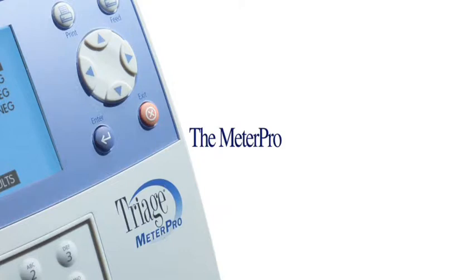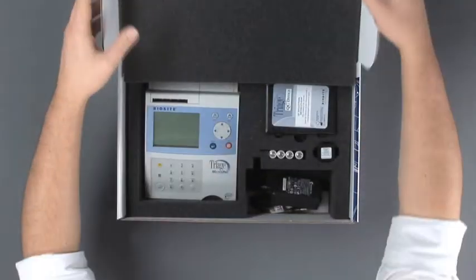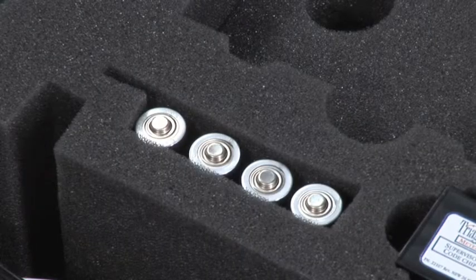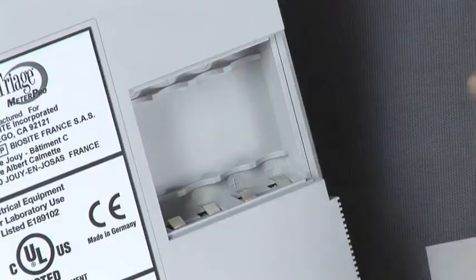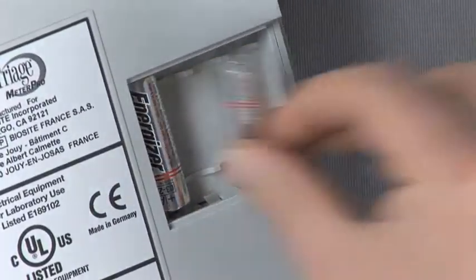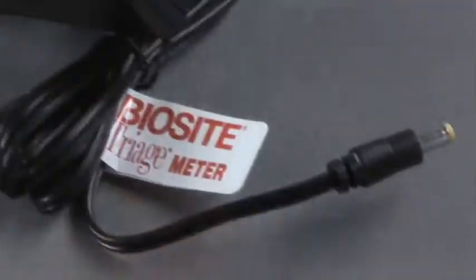The MeterPro. The MeterPro box contains a number of materials. 4 AA batteries. Remove the cover at the bottom of the meter to insert the batteries. Don't do this if the meter will always be plugged into the wall.